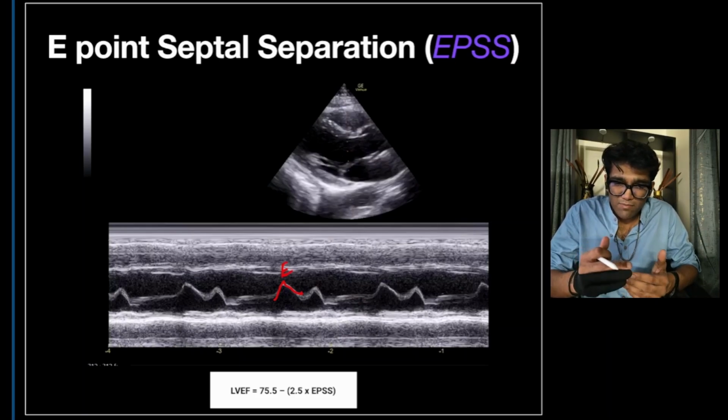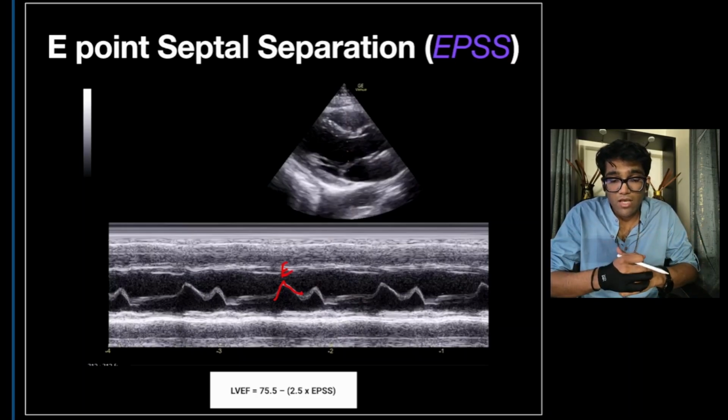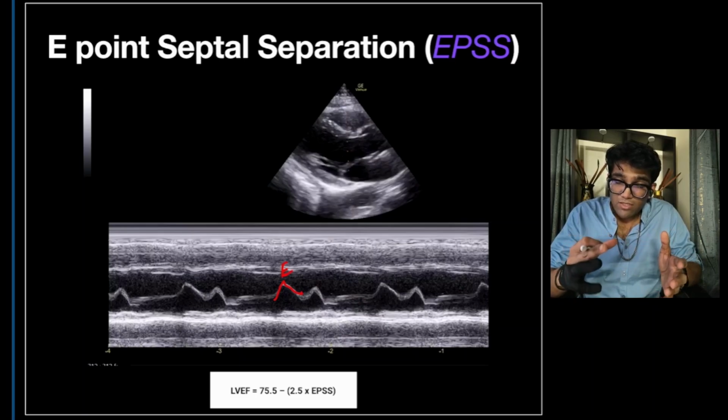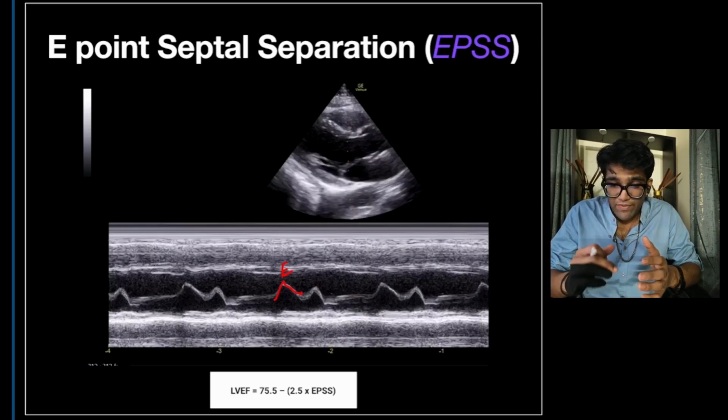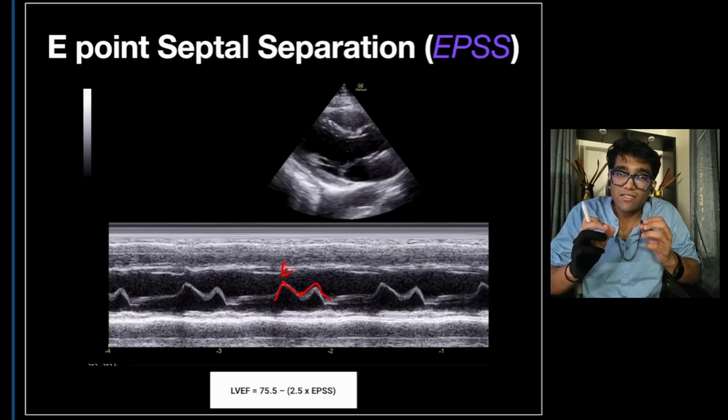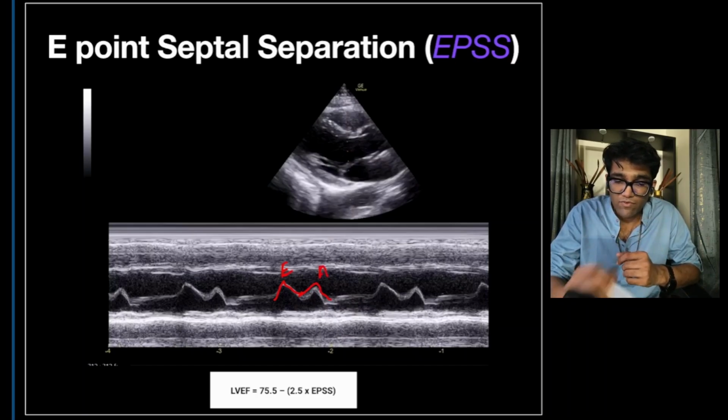And then as the blood fills, that is under a negative pressure due to ventricular relaxation under normal circumstances. Okay, so after that, as blood fills into the ventricle, the negative pressure comes back almost to 0, and then there is a diastasis. Then after that the atrium contracts, and that is what we call the atrial contraction wave or the A wave.